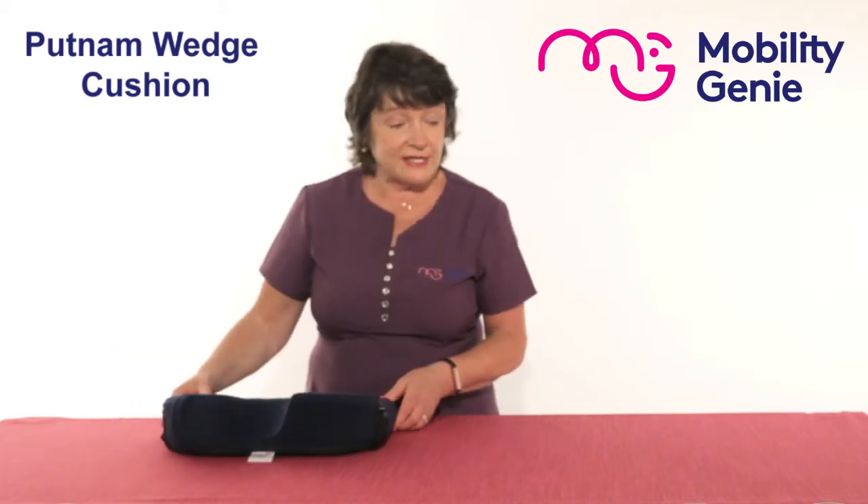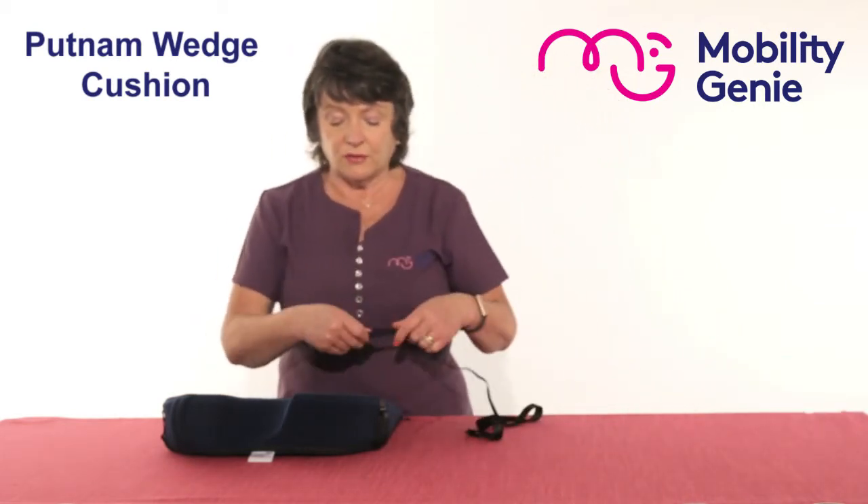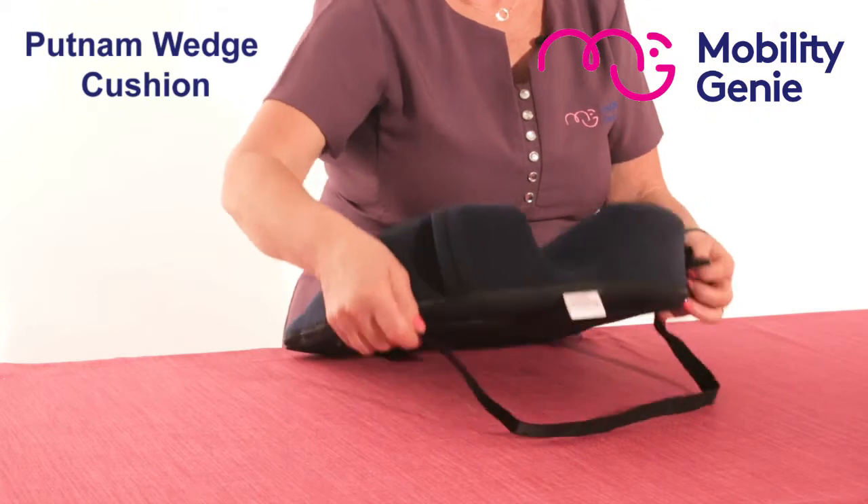They come with a strap that can be attached and wrapped around the under seat of the car.